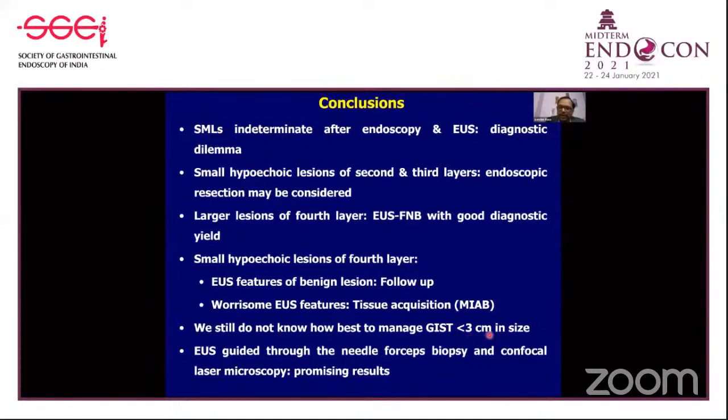So once we understand the natural history of these lesions much better, we may be better able to give an idea of how to manage them. And then EUS-guided through-the-needle biopsy forceps and confocal laser microscopy are promising techniques. The initial results are very encouraging, and we need more data from prospective and comparative studies. Thank you so much for your patient hearing.